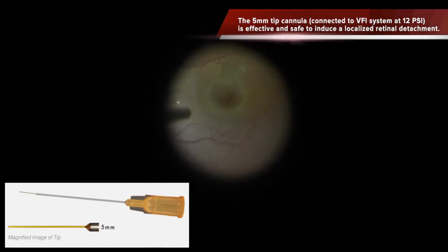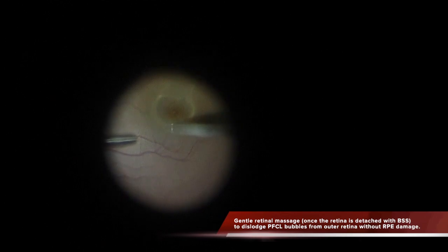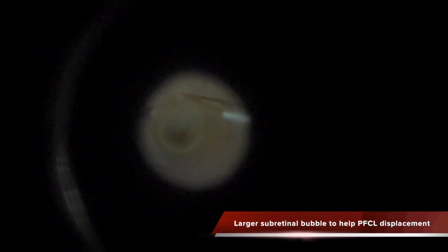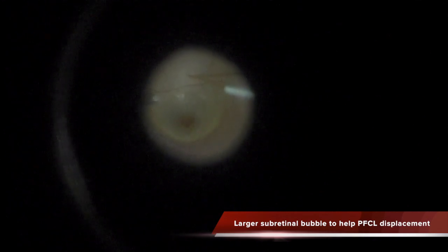First we create a bubble of subretinal fluid, and then with a subtle and gentle massage over the retina, without touching the RPE, we dislodge the PFCL bubbles from the outer subretinal surface. Once the bubbles were detached from the retina, we injected more subretinal fluid to create a bigger bubble and have a higher chance of displacement of these bubbles.